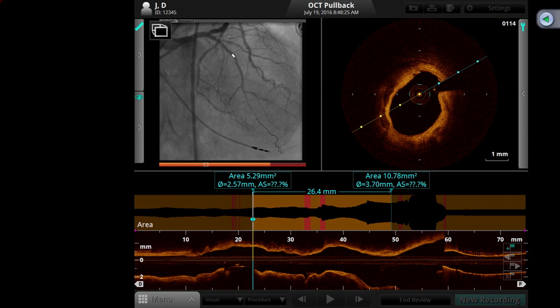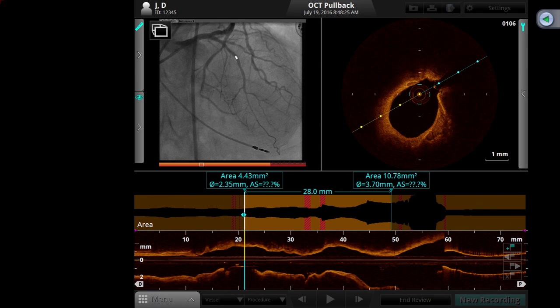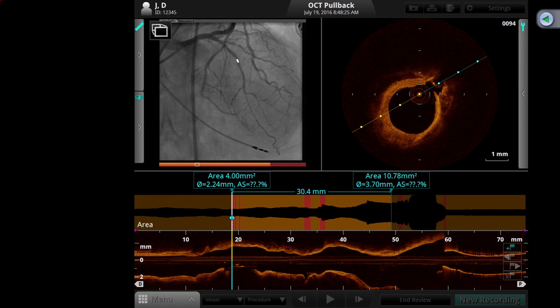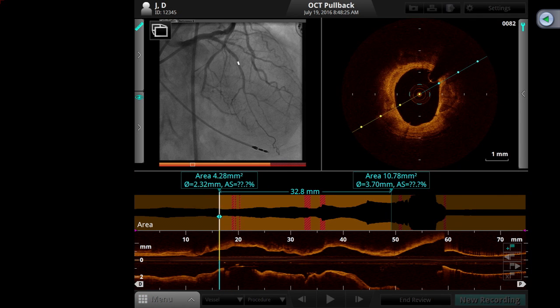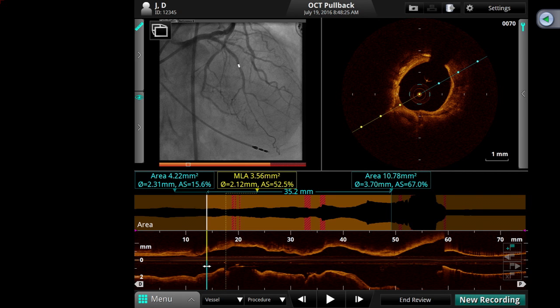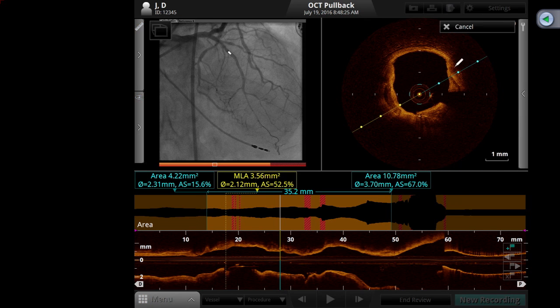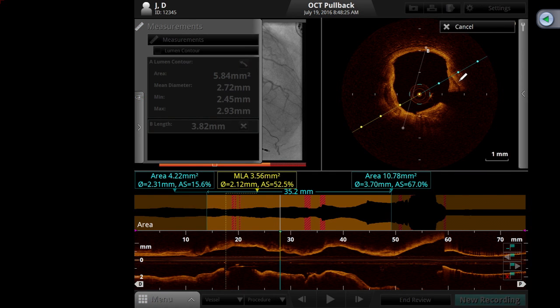Right there. What happened to the screen? Pablo, why can't you fix this? What is the vessel size here? No, go further up. It's the reference vessel diameter we are asking for. You are going too distal. Go back up. Keep going back up. Yeah, this level. I think this is where we should concentrate. I think I would size it by the proximal reference vessel. No, you went too far outside.